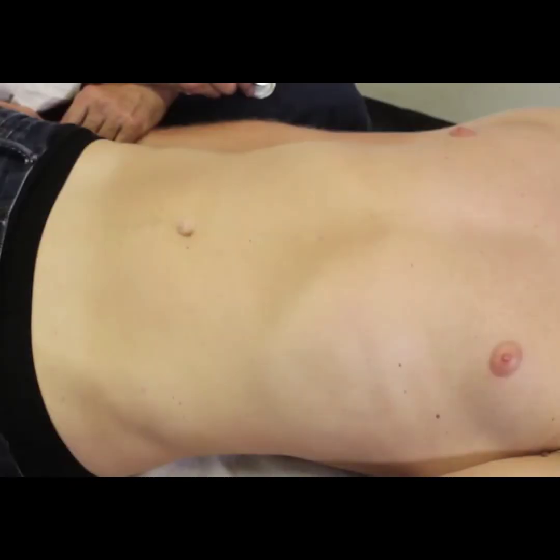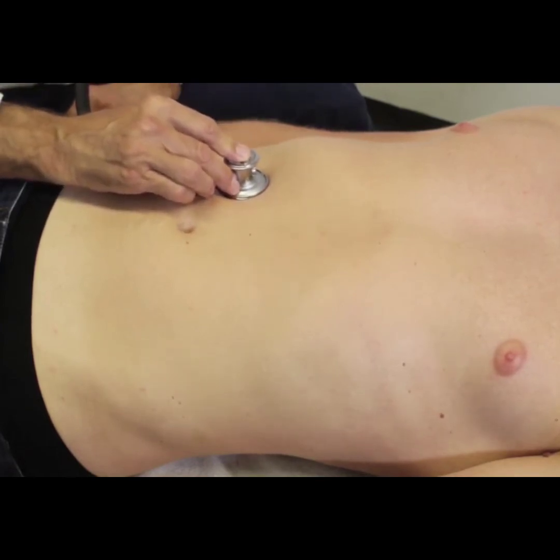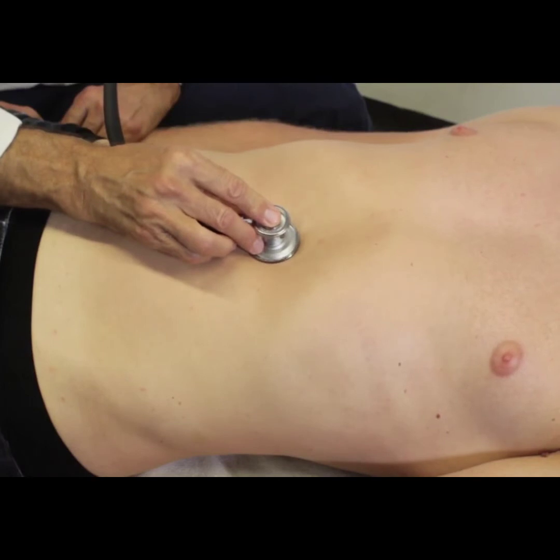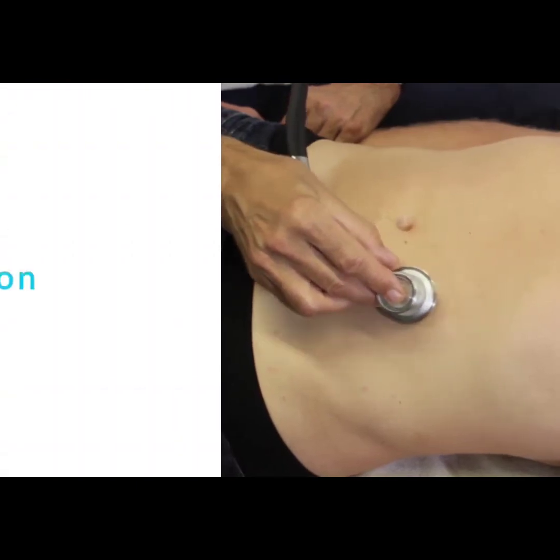Auscultation of the abdomen. Auscultate the abdomen for bowel sounds and check for the presence of hyperactive, high-pitched tinkling sounds and sounds of gurgling, etc. Also auscultate the abdomen for vascular sounds to check the presence of bruits.